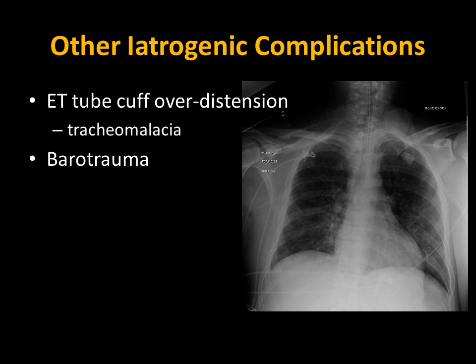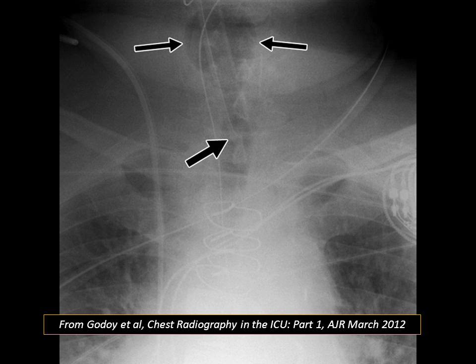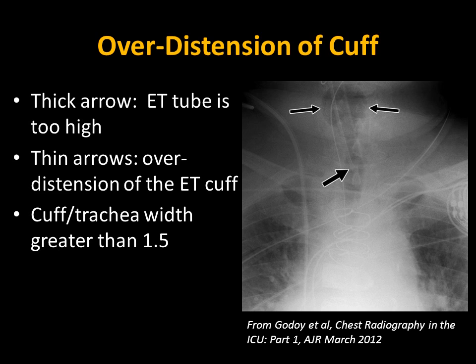There are other iatrogenic complications that can be ruled out with a chest film. An ET tube cuff that is overinflated can cause damage to the airway — this is called tracheomalacia — and you can also get barotrauma. Here's an example of ET cuff overinflation. The thin arrows point at the cuff and the thick arrow points at the ET tube tip. One rule of thumb is that if the cuff is 1.5 times the width of the trachea, the potential for airway trauma exists. In this case, you can estimate that the cuff is at least 1.5 times the width of the trachea. The ET tube also appears to be too high in the airway, and the cuff appears to be overinflated.